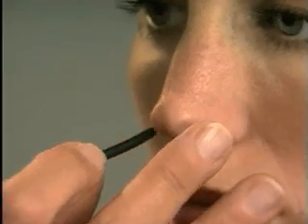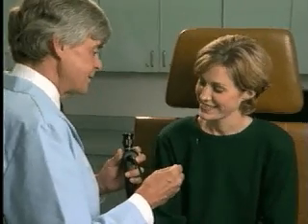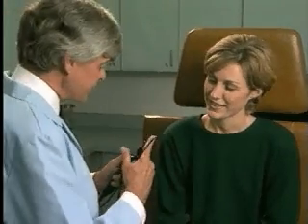At this point, your exam should be complete, with little or no discomfort to the patient. You'll find that the skills needed to perform this procedure are easily learned and improve rapidly with repetition.